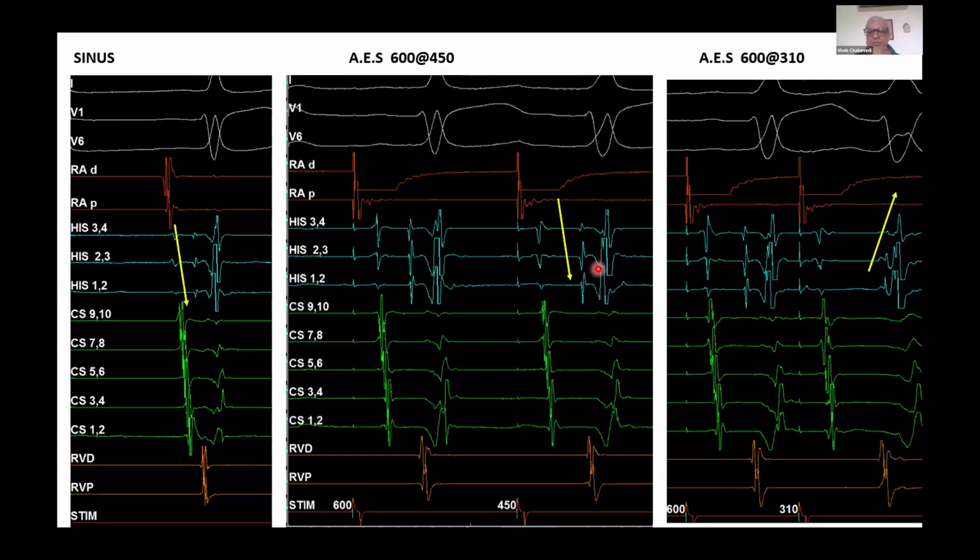Completely agree. But the question arises that when it's in that typical area and you're not getting it from the endocardial side, then that's when you start suspecting. Obviously, these are all high superior tachycardias because the activation is quite superior. Yeah. So usually, Vivek, we see a larger area on the annulus which has almost the same timing with regards to atrial activation. So that sort of gives us the clue that the source is somewhere beyond.